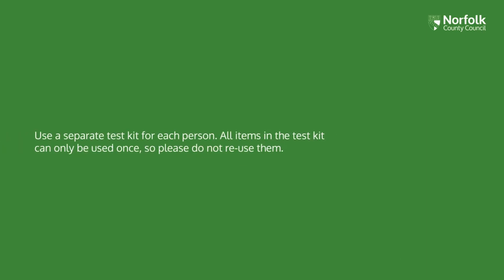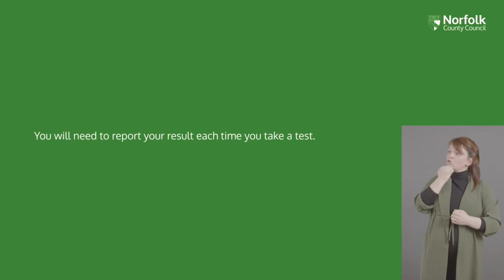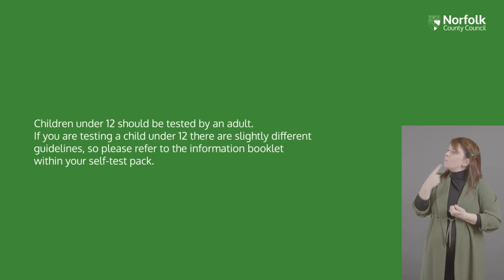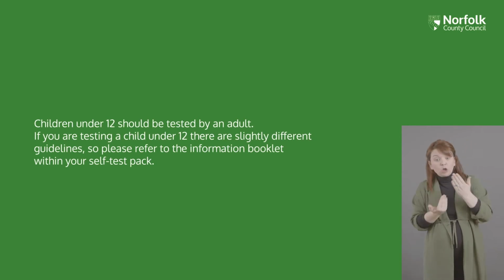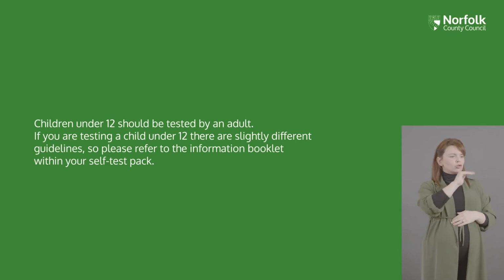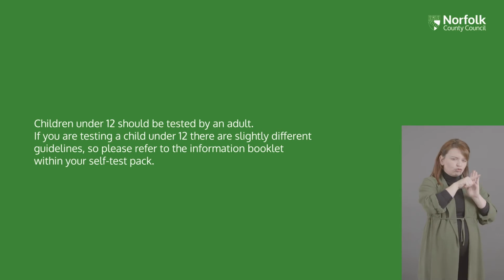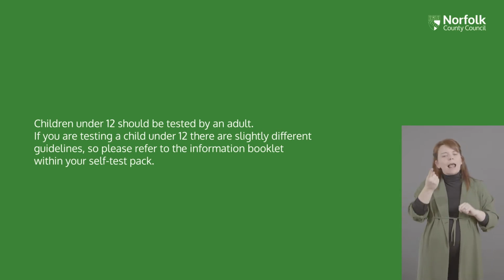All items in the test kit can only be used once, so please do not reuse them. You will need to report your result each time you take a test. Children under 12 should be tested by an adult. If you are testing a child under 12, there are slightly different guidelines. So please refer to the information booklet within your self-test pack.